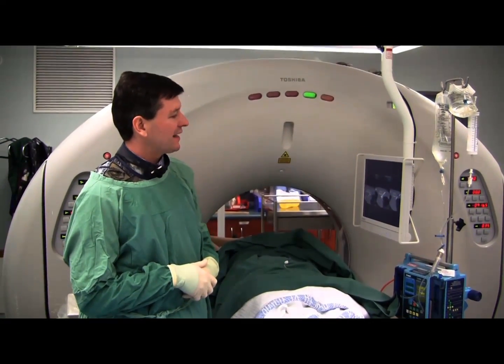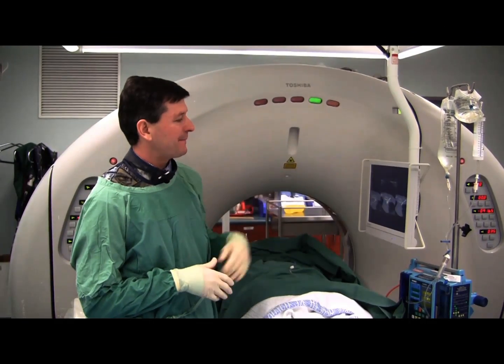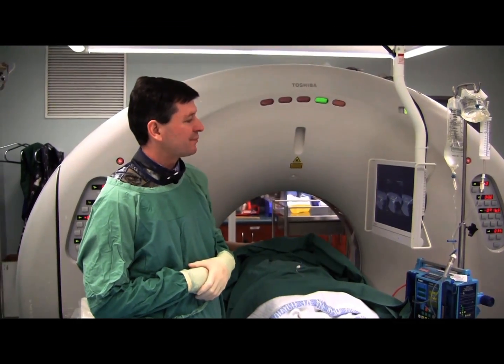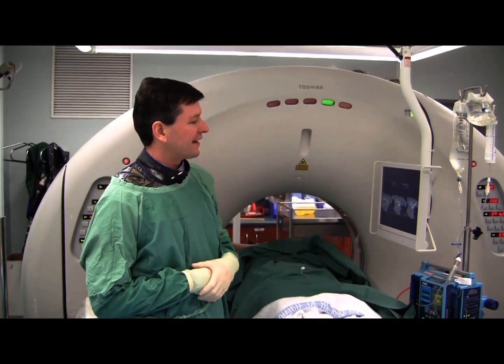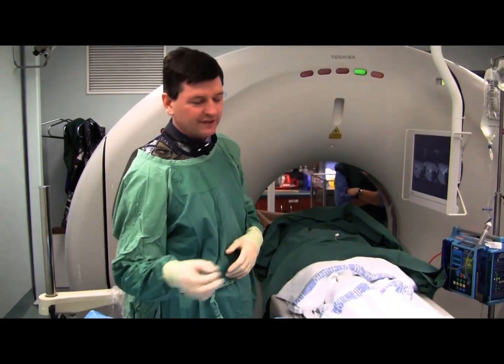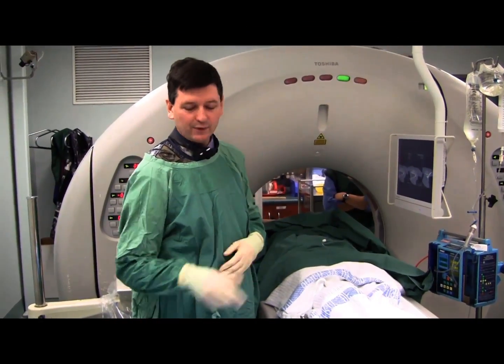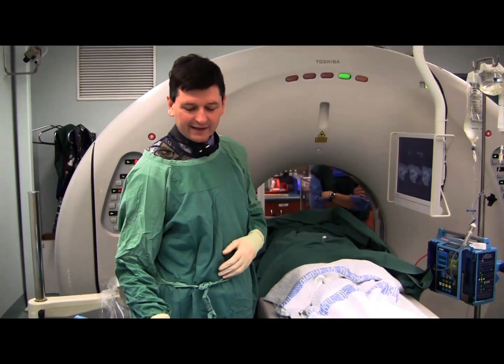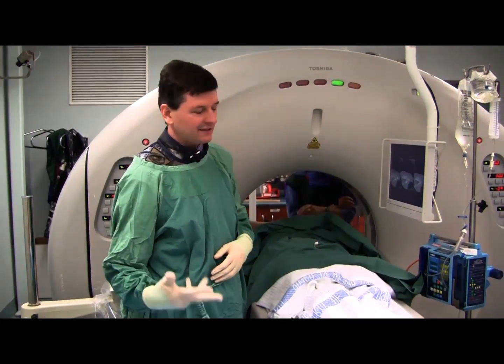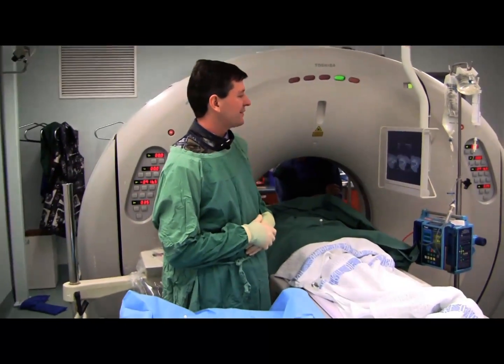The technical issue here was that the geometry of getting the drain past the edge of the sternum was problematic, and I needed to re-site the central stiffener because the drain didn't have enough mechanical strength to continue to feed past that sternal edge, so I needed to put the stiffener back in. Putting a stiffener back in down these drains is always tricky because it tends to snag on the draw wire inside the drain, but we've got the drain now where we want it to be.